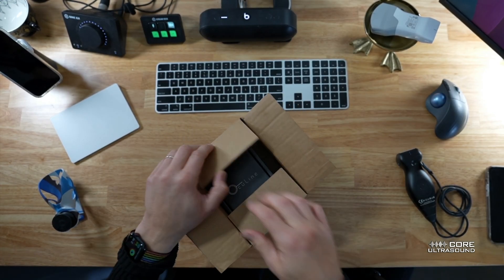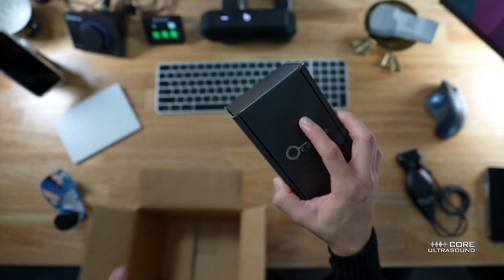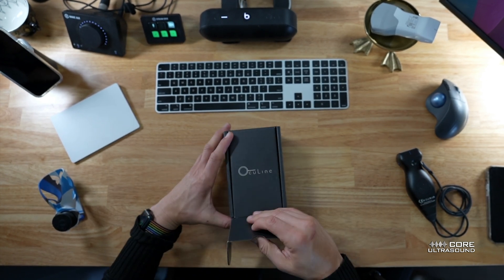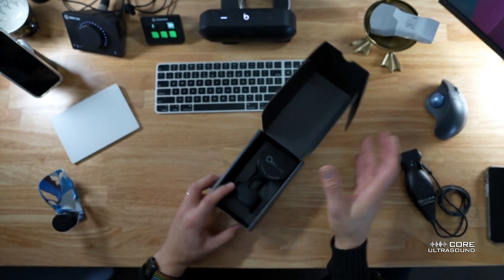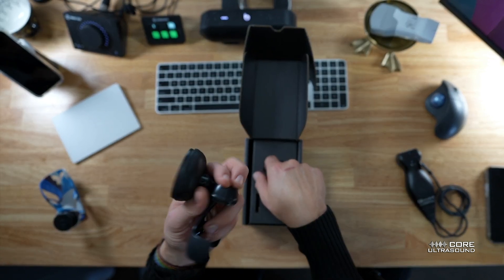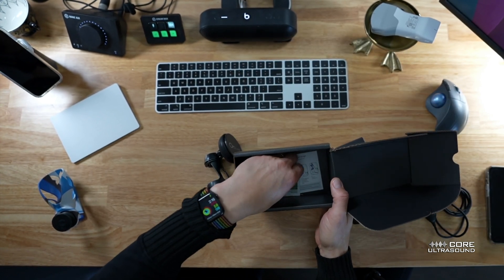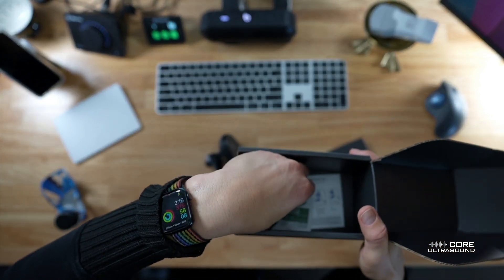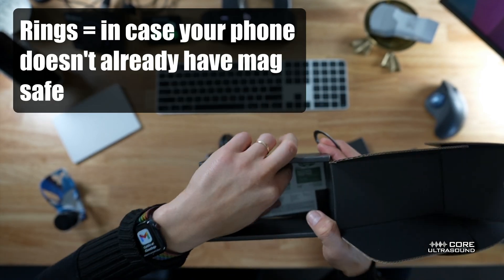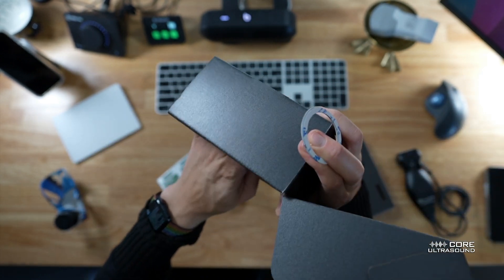So this is how the box comes — kind of cool, kind of nifty. We are going to remove it. Pretty simple, just has the device in here. We have some cleaning stuff in here, a couple of extra rings, some alcohol pads, and it looks like some instructions.